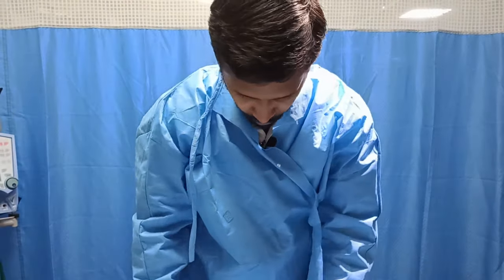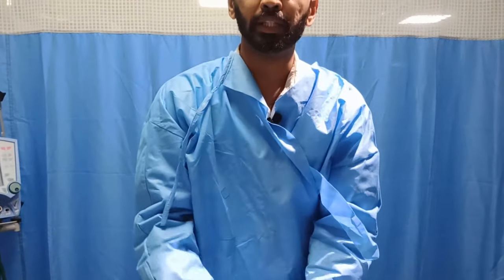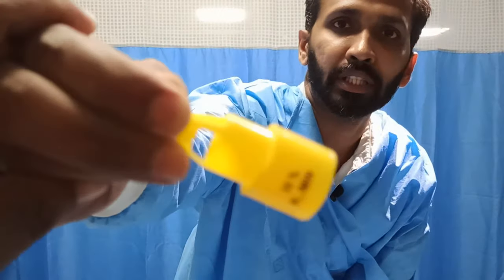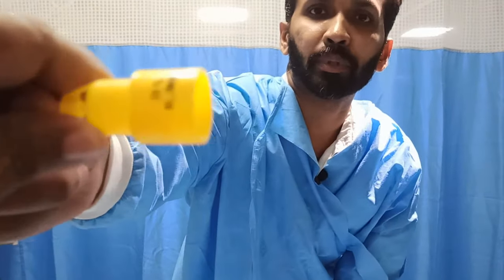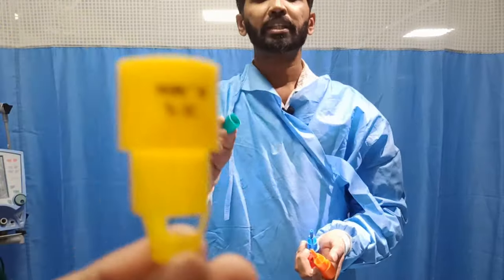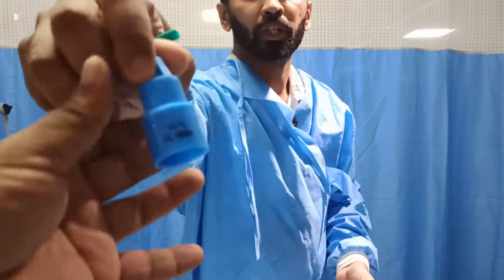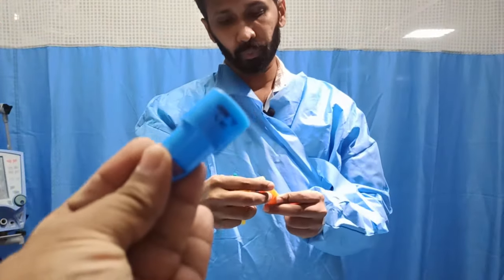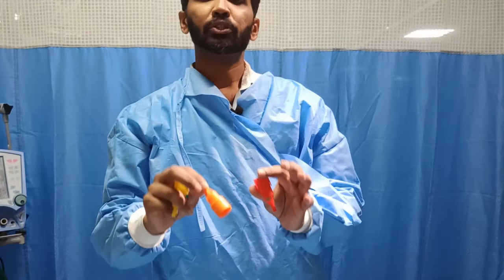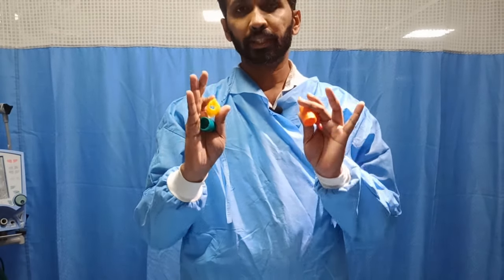There are different types of venturi masks depending upon the flow of oxygen. The FiO2 is marked on each venturi device, like 8 liters per minute, 35%. That means if you are delivering oxygen at 8 liters per minute, it will provide a FiO2 of 35%. Just like that, there are different venturi devices: 15 liters per minute ensuring 60% FiO2, 2 liters per minute ensuring 24% FiO2, 6 liters per minute ensuring 31% FiO2. So using a venturi mask, we can precisely assure a prescribed amount of FiO2. That is the use of a venturi mask.